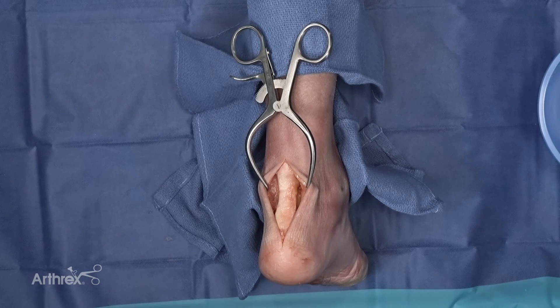Hello, I'm Dr. Steve Brigido, and today we'll be demonstrating the use of Centiflex, a human placental matrix that can be utilized to augment the repair of periarticular tendon disease and injury. In this particular instance, we'll be simulating an Achilles tendon rupture that's been repaired with the modified Bunel approach and number two fiber wire.